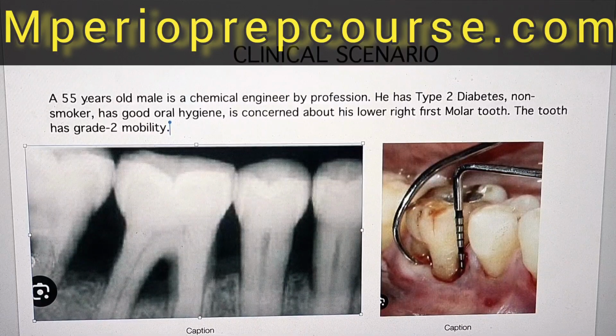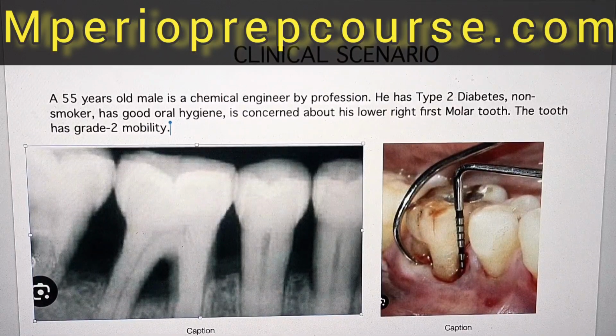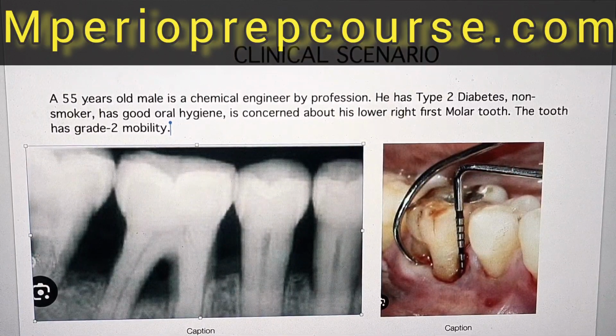Yes, it is a periapical radiograph with grade 2 quality showing lower right 4, 5, 6, 7. There is horizontal bone loss around 50 to 70%, and there is an interradicular radiolucency in lower right 6, which suggests involvement of grade 3 furcation, but I will confirm it clinically.